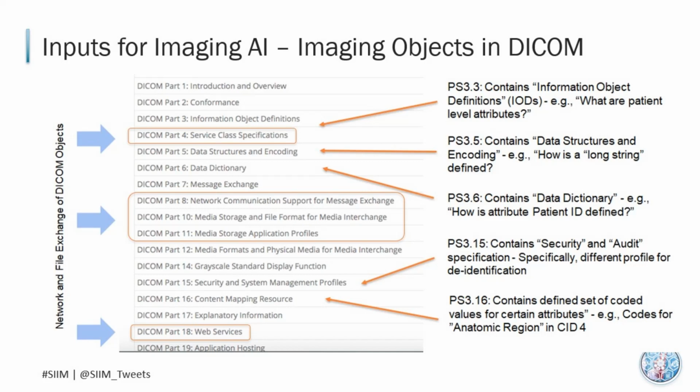Oh, totally. Now, I remember from our previous conversation that DICOM Web is the modern exchange protocol, but of course, we've had to support the DICOM binary protocol to communicate with the PACS. It's quite reasonable. The main challenge we're having is understanding the data model. Fully understood. Let's dive right into the data model then.